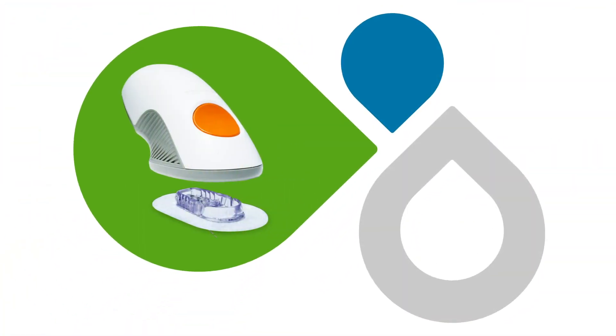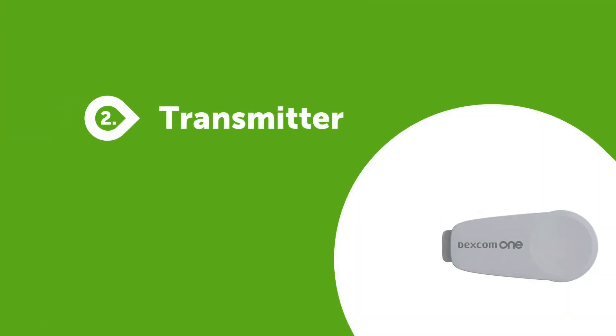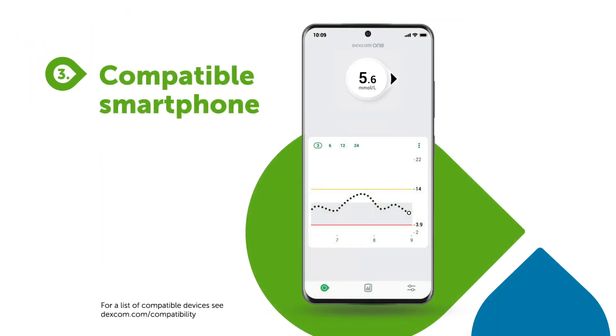The applicator with built-in sensor, the transmitter, and your compatible smartphone for displaying the data.